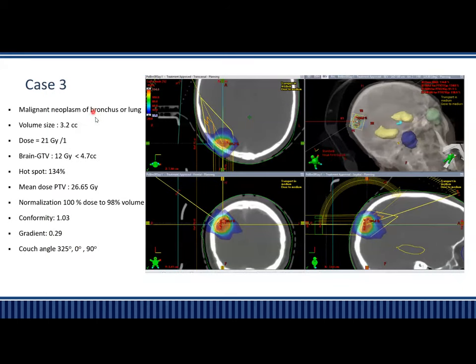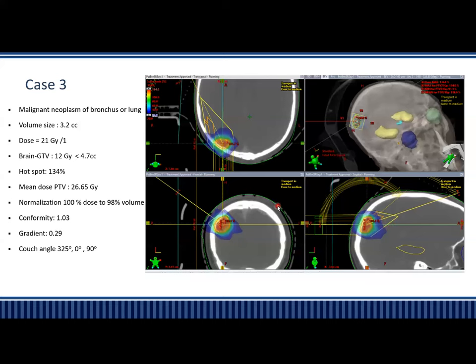Another case: malignant neoplasm of bronchus with a volume of 3.2 cc, which is somewhat larger. The dose is 21 Gy in 1 fraction. Brain minus GTV is less than 4.7 cc, hotspot is 134% from the posterior side. Couch angles of 90, 325, and 0 degrees were used, and again it's quite conformal.